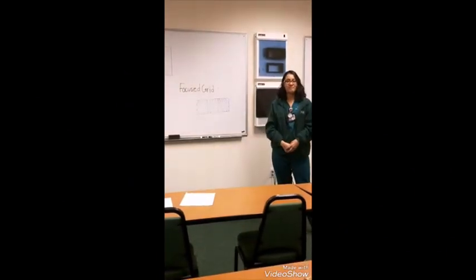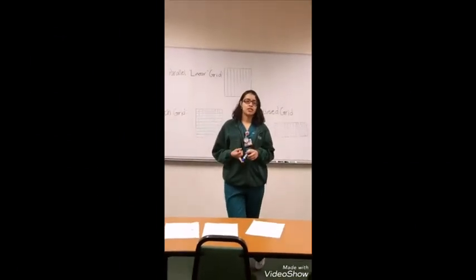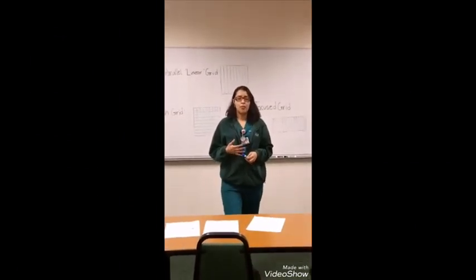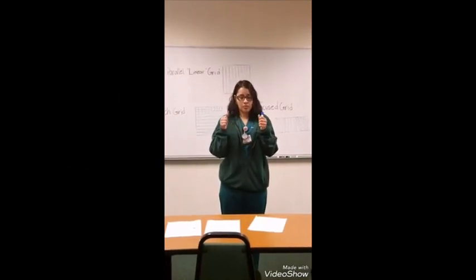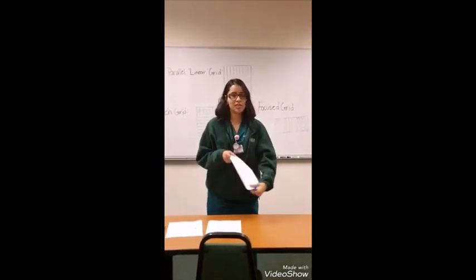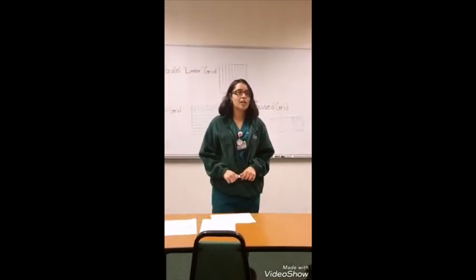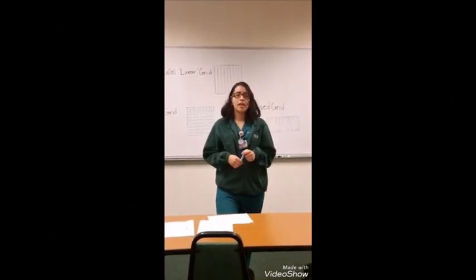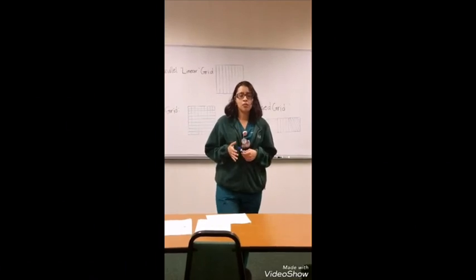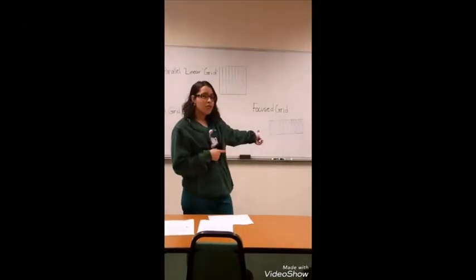All these grids can actually be used as either moving or stationary. That means that when you use it as stationary, it's not going to move. So it's literally just like this. You put it down and you can use it wherever. Usually that's when you're going to do a mobile X-ray. Moving grids are when they're placed inside of a table. They're already installed, and that's usually with a focused grid.